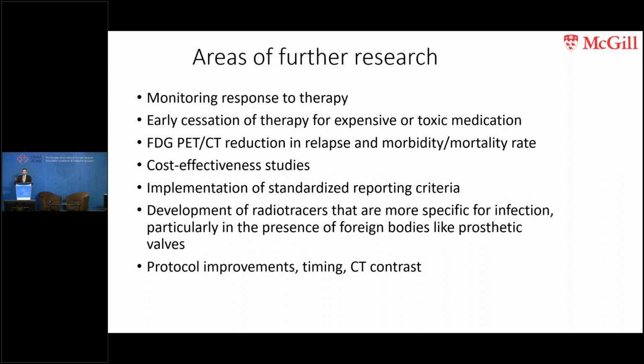So there are sometimes missing some standardized reporting criteria that we need to develop. Can we have some more infection-specific radiotracers, especially when there are prosthetic materials such as prosthetic valves? That could definitely help. And we can always work on protocol improvements, better PET scans.